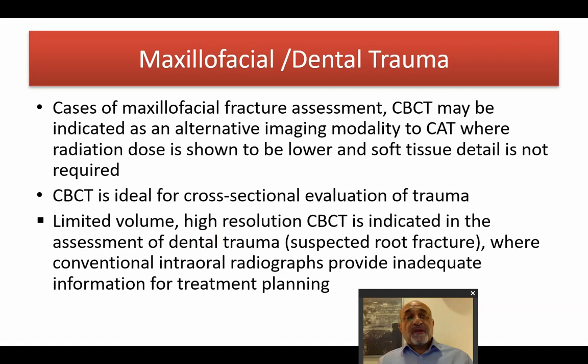Trauma. Cases of maxillofacial fracture assessment, CBCT may be indicated as an alternative imaging modality to the CAT scanner. I would say that in cases of trauma, whether involving the teeth or the alveolar bone or the maxilla and the mandible, CBCT is indicated.